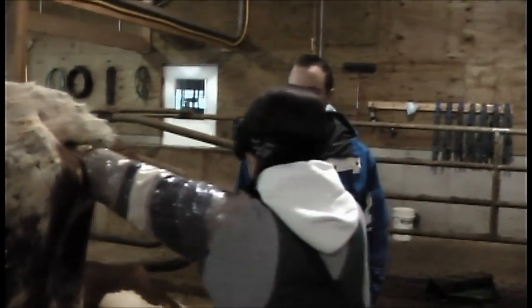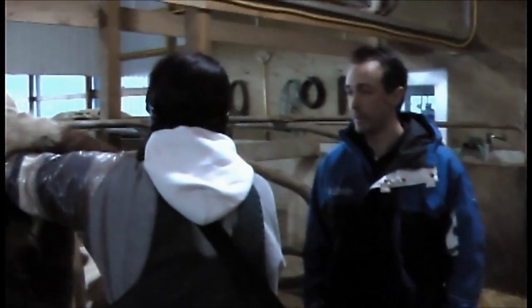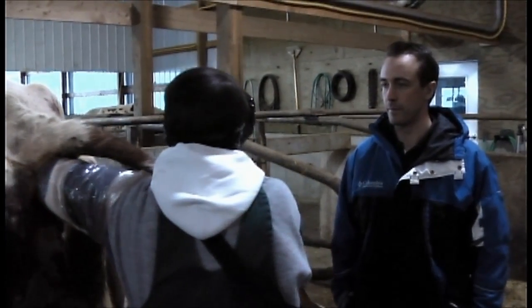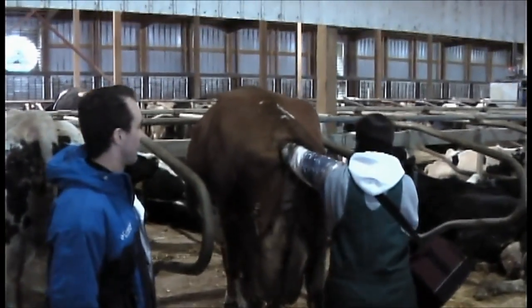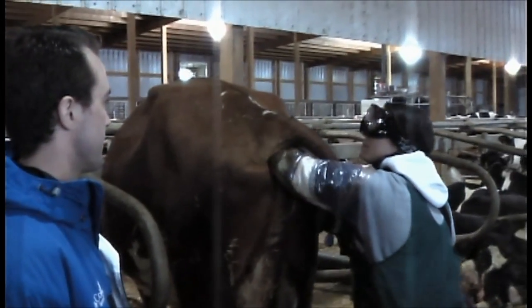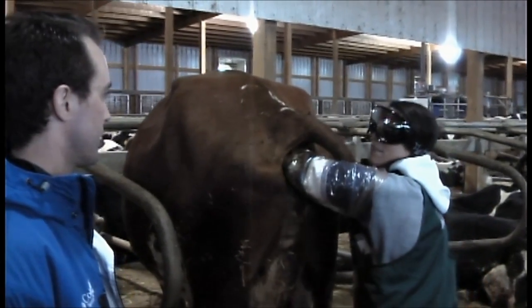She's 60 days. She had a hard calving last time and had twins, so I'd like to make sure she doesn't have twins again. Well, I see a single fetus on my probe, so she should be alright to dry up at normal times. She's a high genetic animal, double polled, so we'd really like to know if we have a heifer calf out of her. I'm approximately 50% sure that it's going to be a heifer calf — I can see the evidence of that.